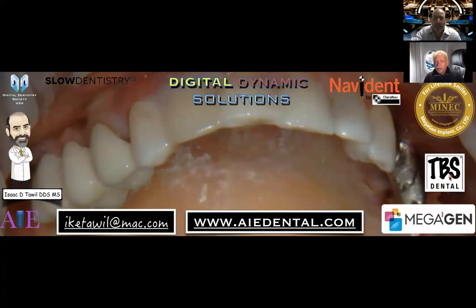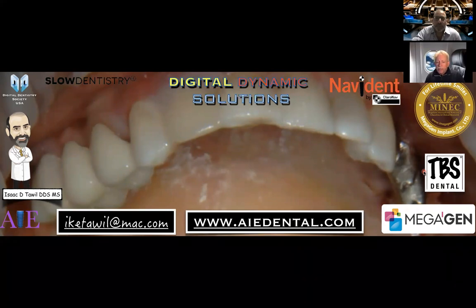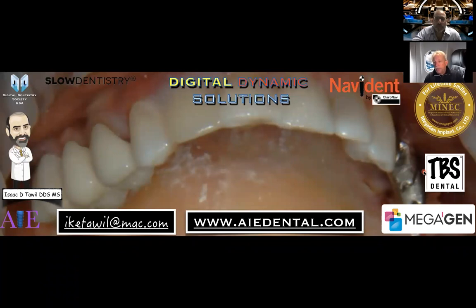Well, I think the other issue that I want to make sure we impart to the audience is that we don't want people running out there and trying to push the envelope, especially with these transcrestal cases using densiburs. We don't want them, on their first case, trying to raise it 6-8 millimeters. That's just not the way it was designed.